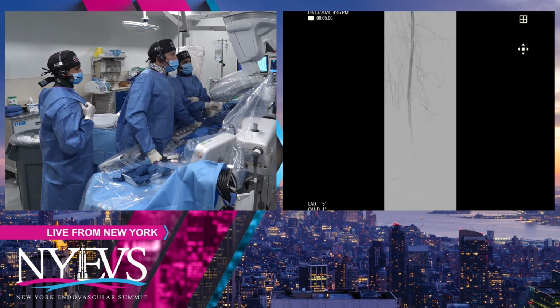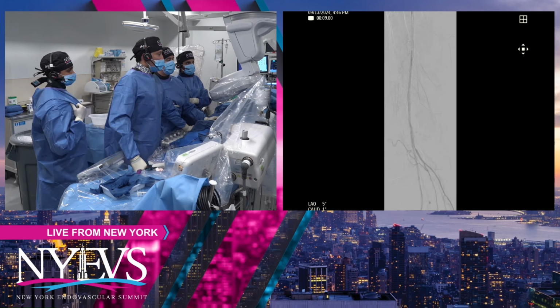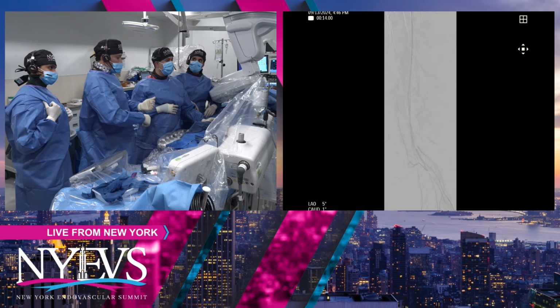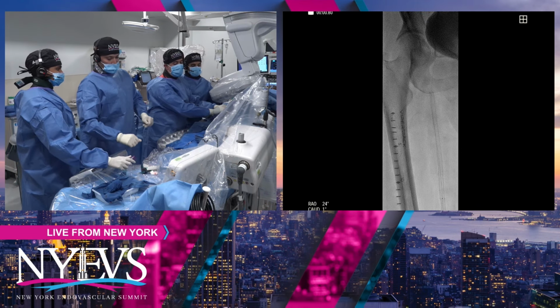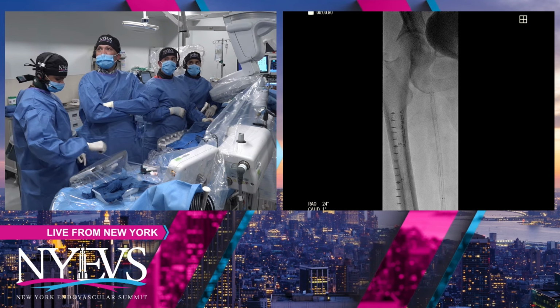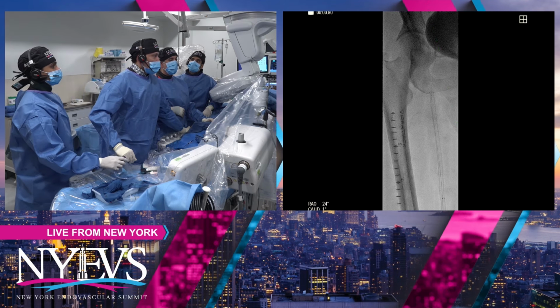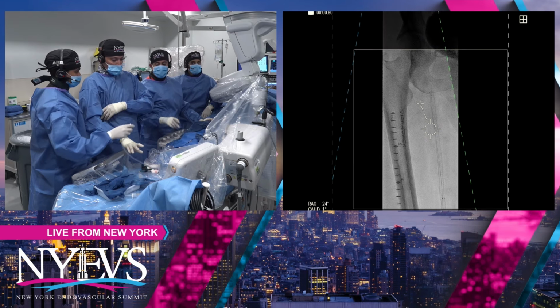If you aggressively post-dilate an in-stent occlusion, during this dilatation process you mobilize some embolic particles going downstream. And I have the impression that the filter has captured some of these emboli. Yes, I don't know if you heard the whole thing because of the microphone, but Dr. Zeller was saying take the filter out and then see what the flow is really like, just to make sure that it's not being inhibited by debris. Did you do a non-DSA?